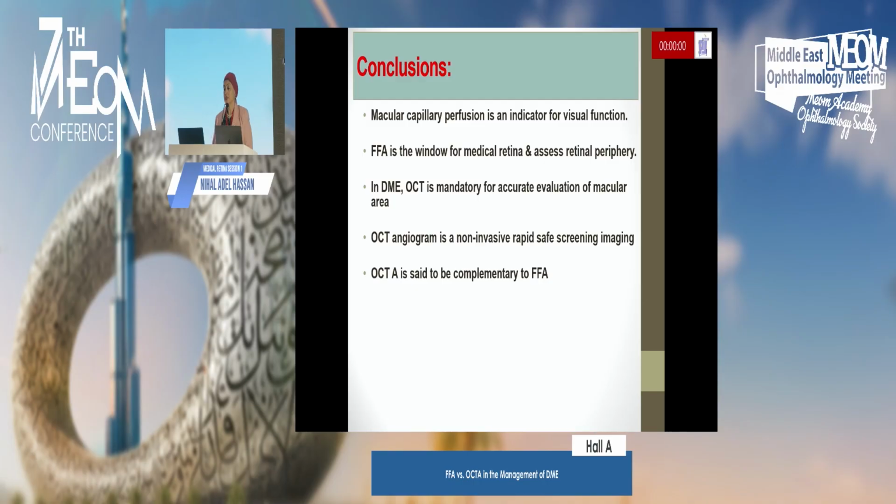But in diabetic macular edema, OCT of course is mandatory. I can't take a full assessment of the patient without a full assessment of the macular area, vitreoretinal tractions, macular assessment, and macular thickness, which is the last one to be commented upon. But all the OCT biomarkers that we rapidly went through are very important to be documented. And OCT angio being non-invasive, rapid, safe, very convenient to the patient, will have the upper hand for the coming era. But we said before that OCT is complementary to fluorescein angiography in diabetic macular edema.